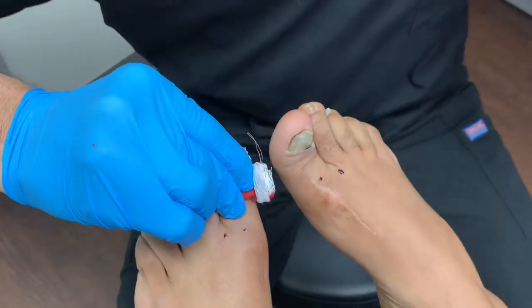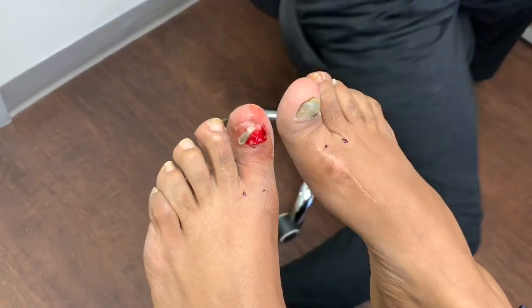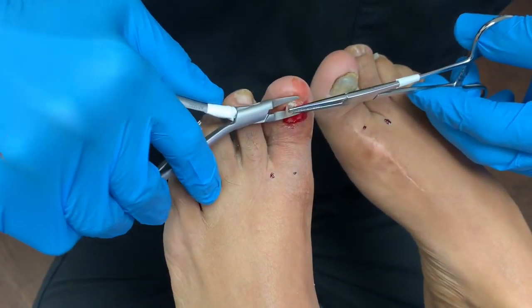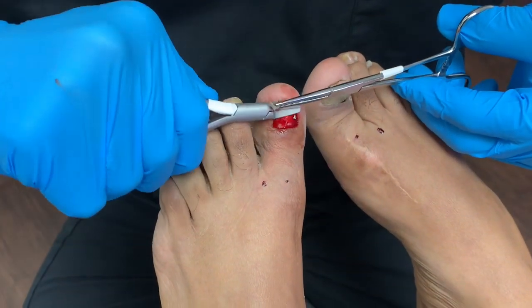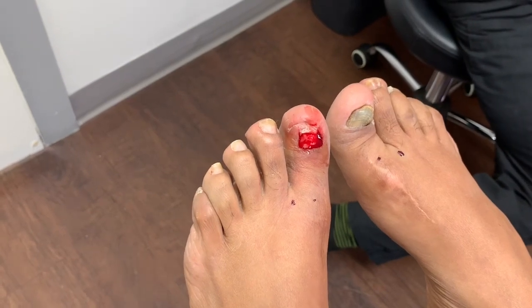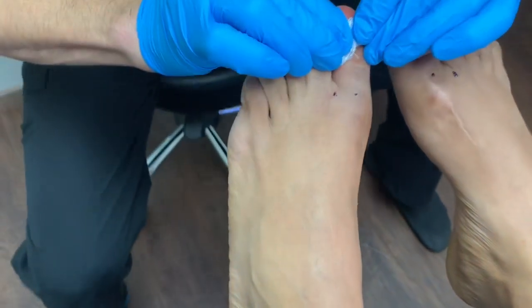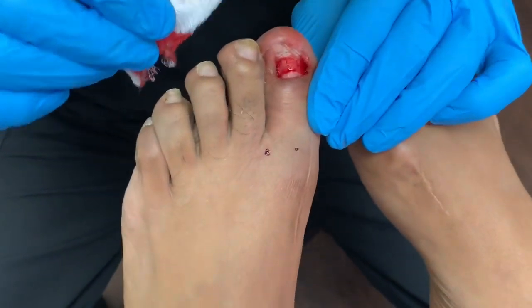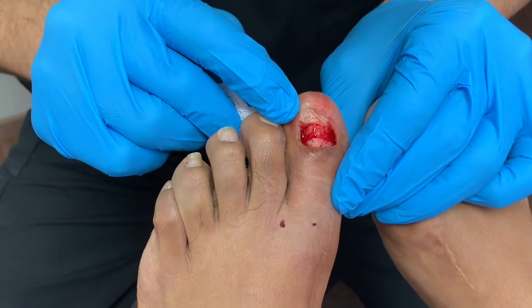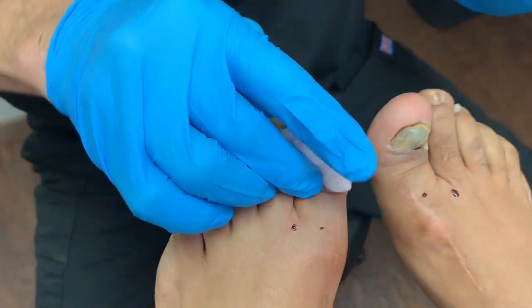Now let's take a look at what the nail bed looks like. It's really nice. It'll be very interesting to see what we find on the other side.